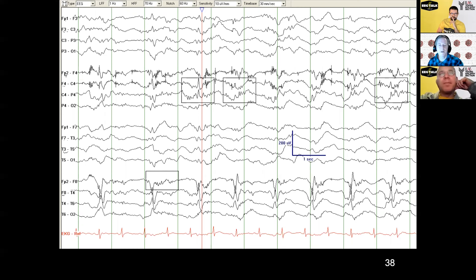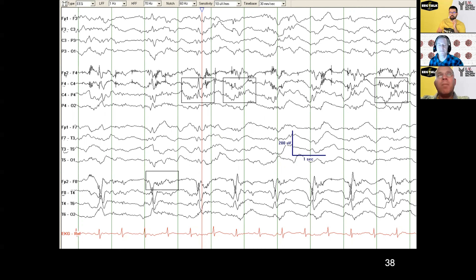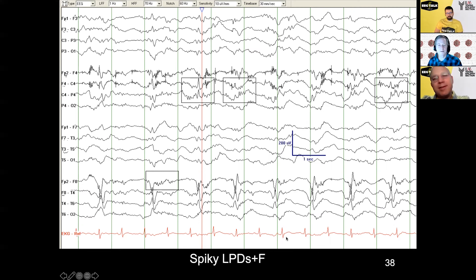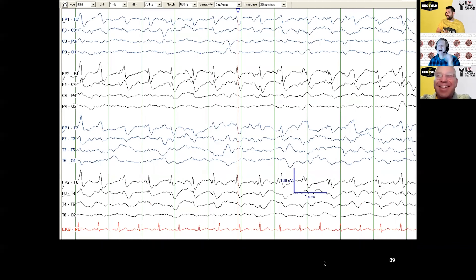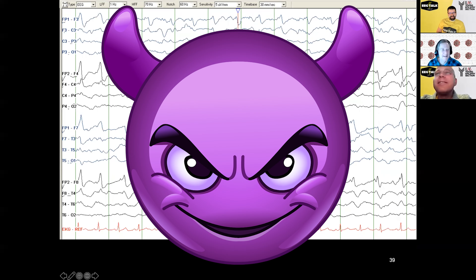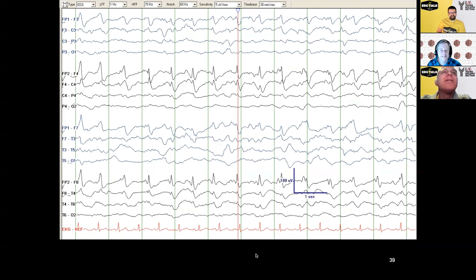Here's a good example: right lateral periodic discharges with a little burst of fast activity — you can see it here too. This is LPDs+F for the superimposed fast activity, which means there's an even higher association with seizures, and long-term outcomes may also be more likely when there's a plus modifier. We also added a modifier for sharpness, because these are pretty spiky.